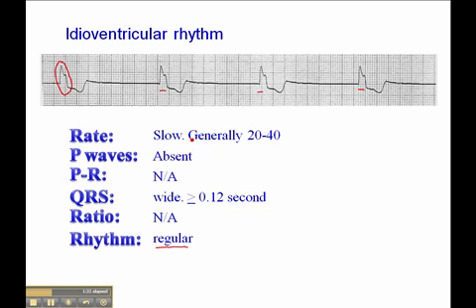I mention that only because if you had the same consistent QRS morphology but the rhythm was irregularly irregular, then if you think back to one of the early rhythms we looked at, in order for it to be irregularly irregular, the underlying rhythm would probably have to be an atrial fibrillation.